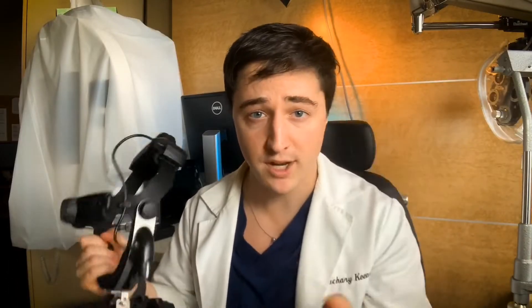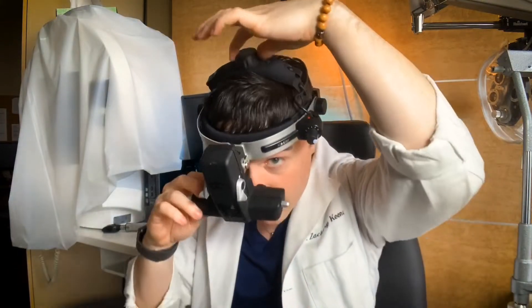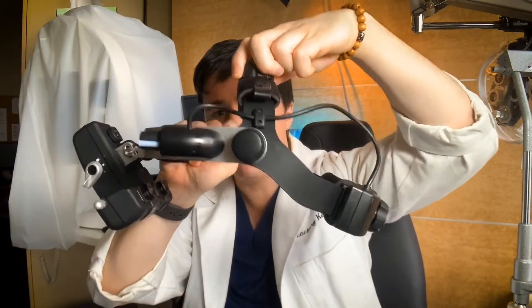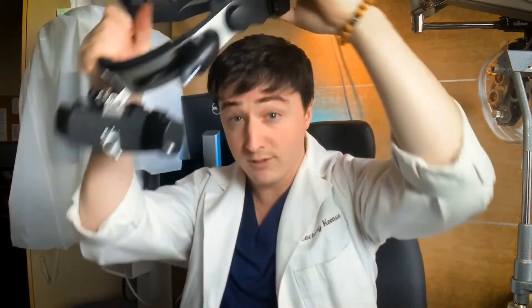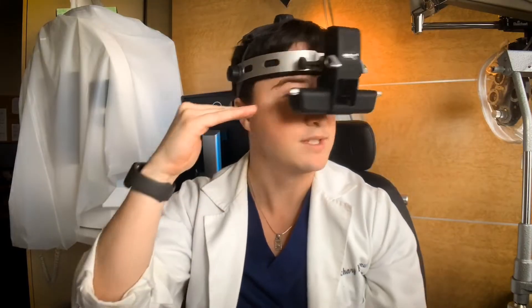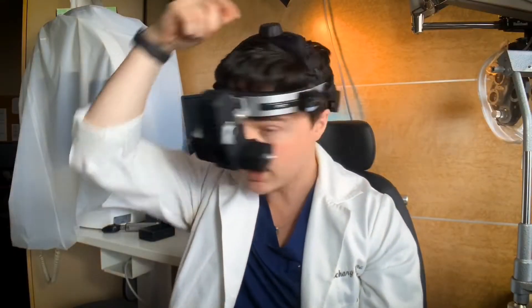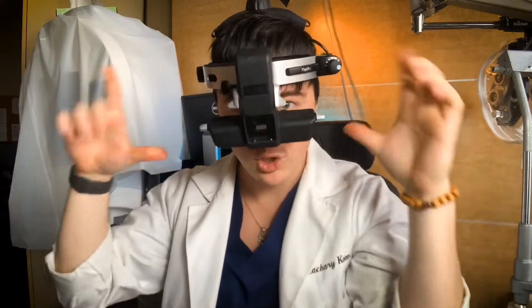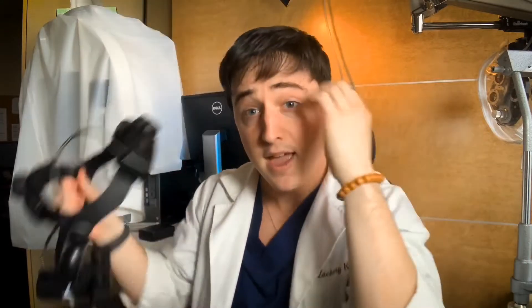First things first, you're going to put it on your head. It has two knobs to adjust how it fits. The top knob adjusts the height — where it sits on your head, it tightens up and down so that the part you're looking through is in line with your eyes. The back knob adjusts the size, so if you have a little head, you tighten it down to fit. Get it nice and snug so it's not going to fall off no matter which way you look.